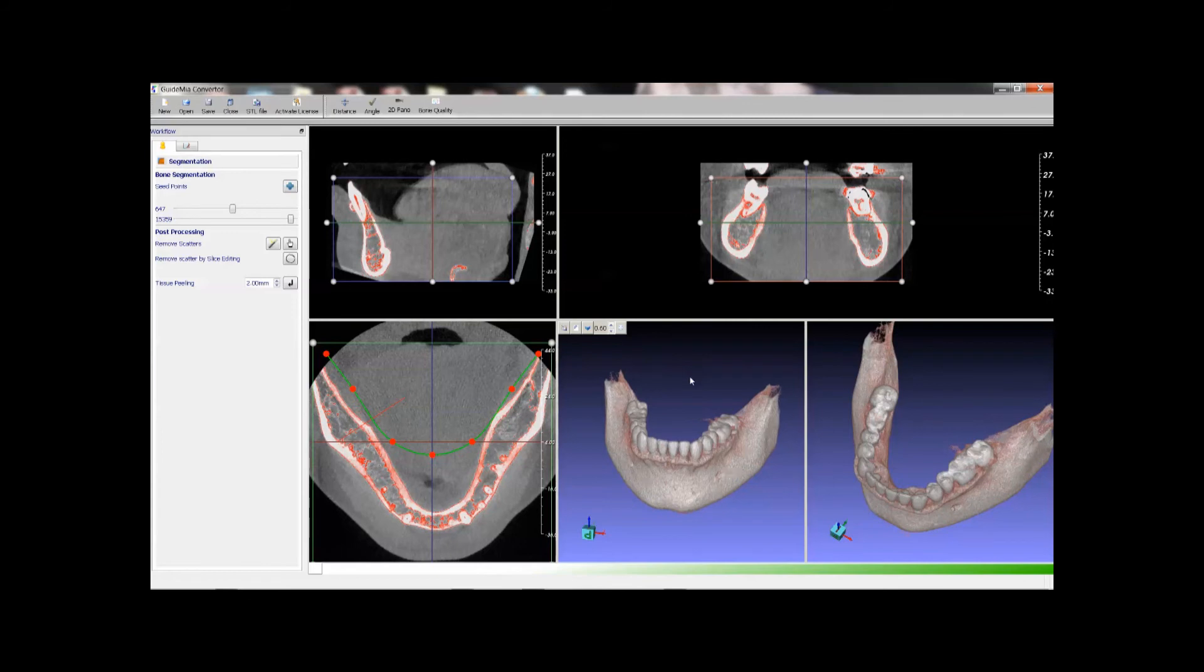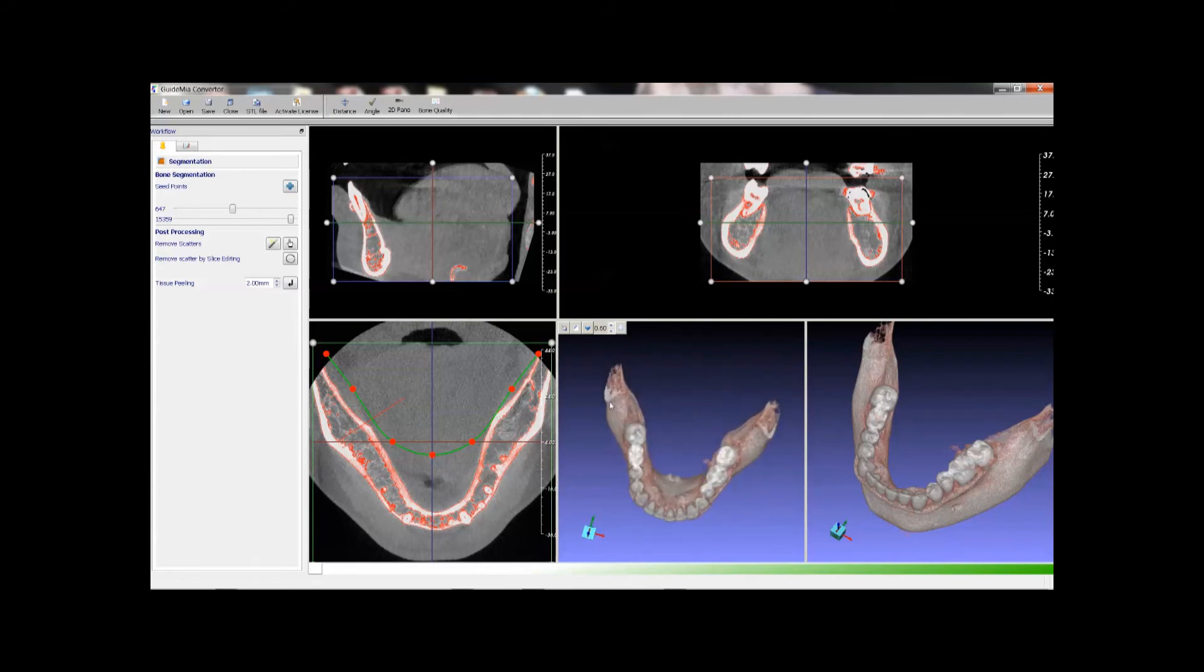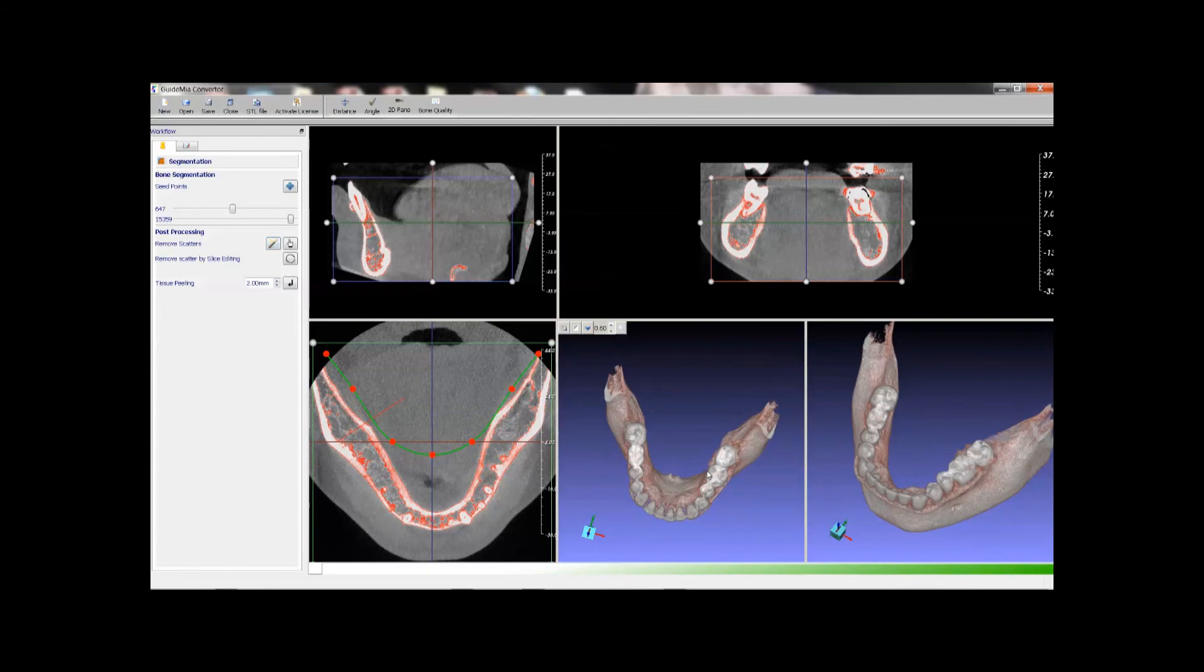There are still scatters on the model. We use this automatic scatter removal tool to remove them first. This is the manual scatter tool.